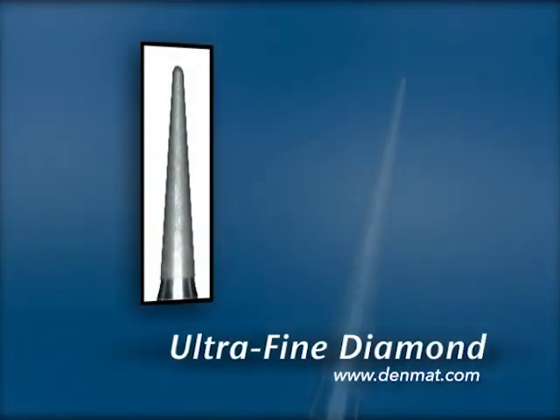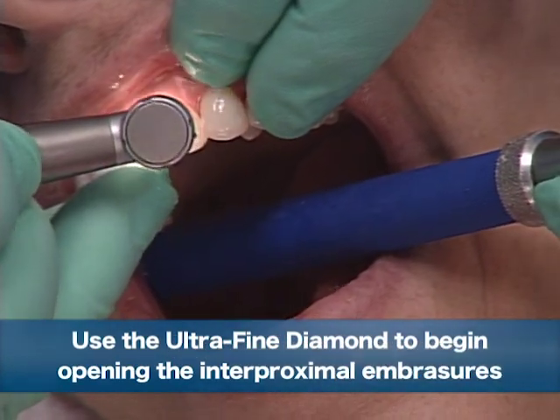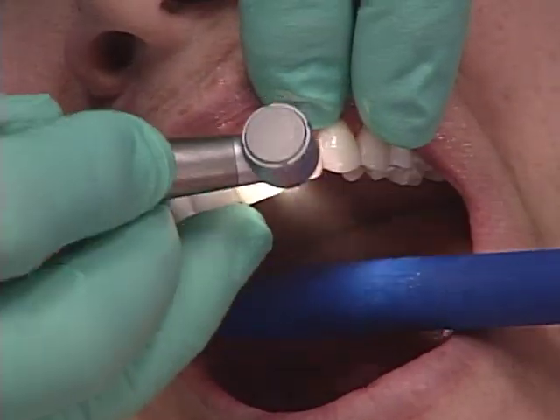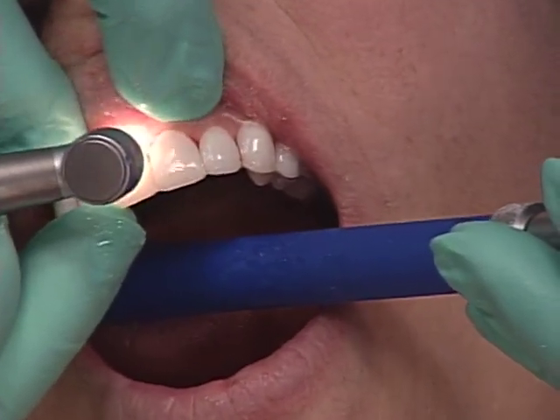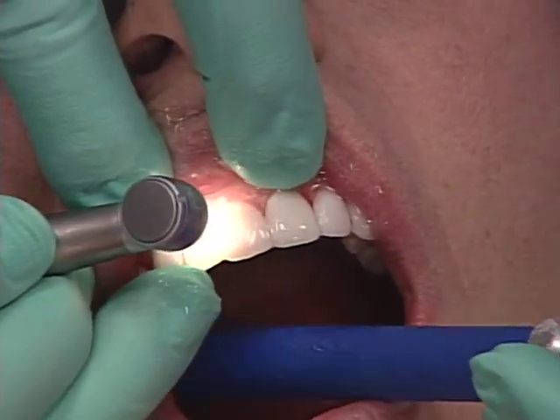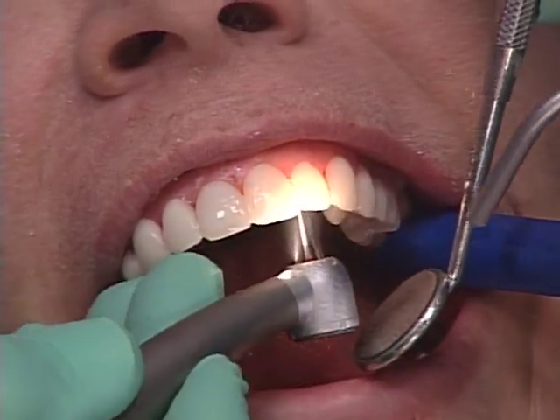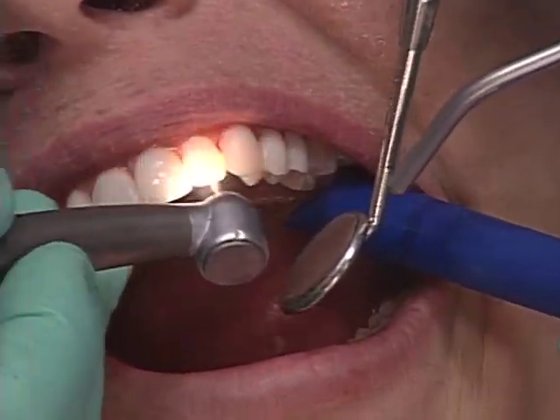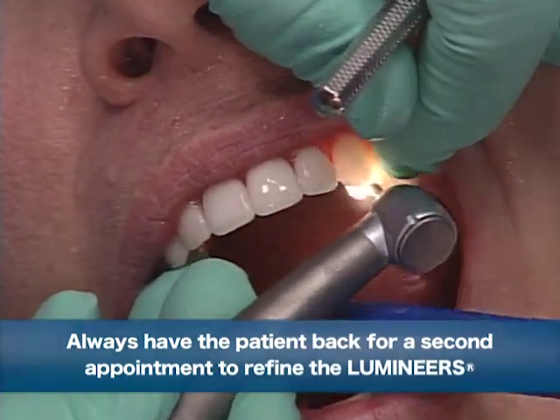Now we're going to take this long, narrow diamond. Now I'm just going around here getting those interproximal embrasures, because you're probably wondering how we open those contacts, right? If you have trouble opening the contacts, it's probably because you have too much Ultrabond left in there, and then you just stop and go back and remove it. Now here I've got a little Ultrabond in here that I had missed, and I'll go back to the football-shaped diamond, and we do the final finishing on your next recall visit, or follow-up visit I guess is better.